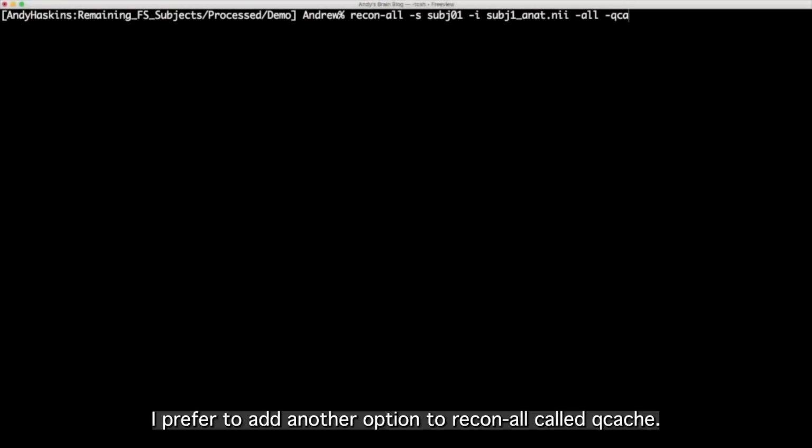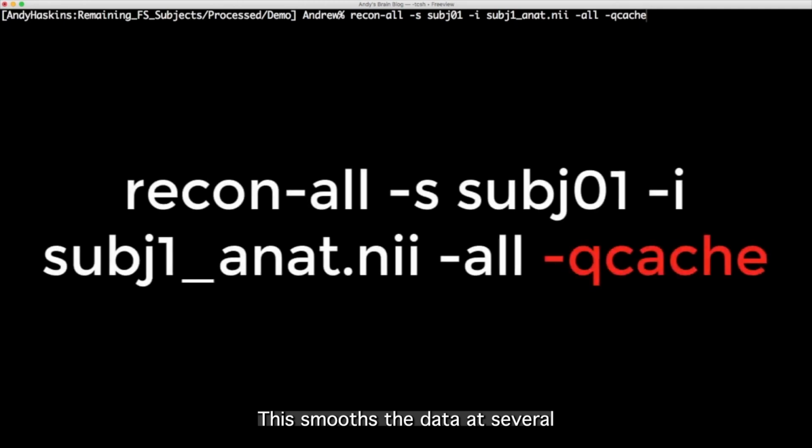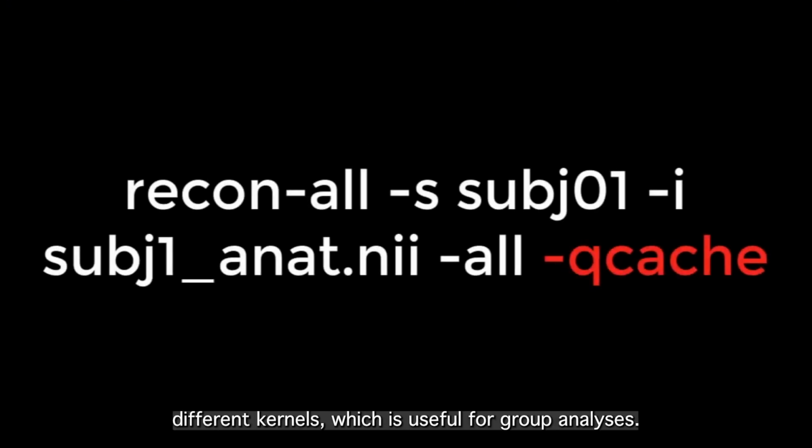I prefer to add another option to recon-all called qcache. This smooths the data at several different kernels, which is useful for group analyses. We'll cover that and more in the next tutorial, when we prepare our data for group level analysis.